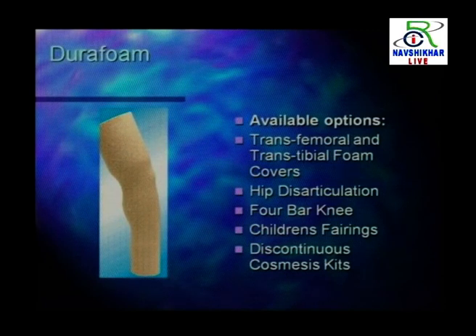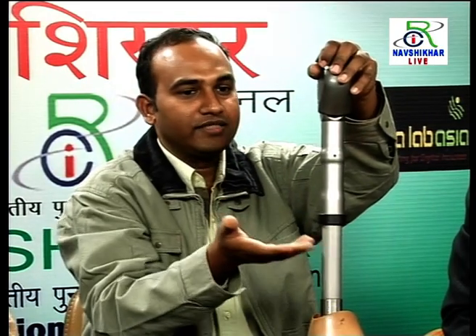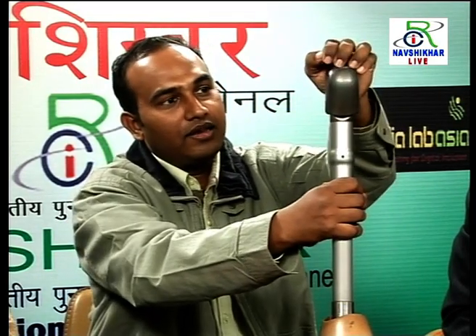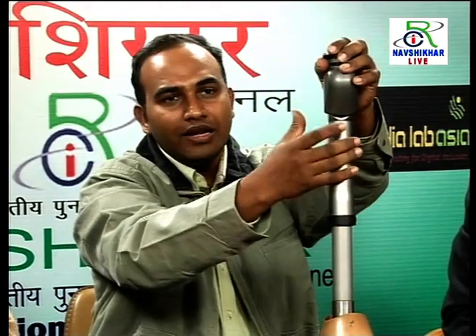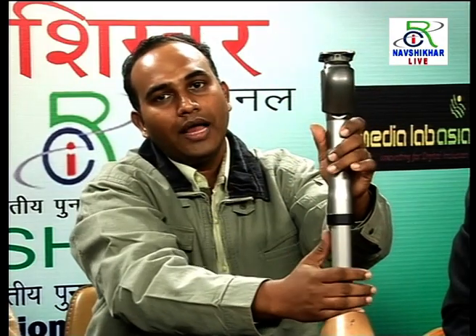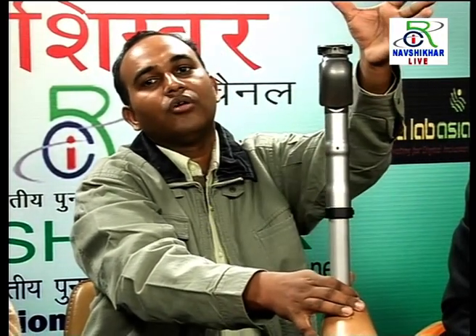Then there are cosmetic coverings that are supplied with the above knee components or below knee components, when all the systems are incorporated. If a patient wants to go out, say a female patient wearing a short skirt, it will be open, so definitely it will look very odd, like a robotic leg. So every company supplies covers; some patients use them, it's basically a patient choice. It's a leg shape cover, very lightweight and water resistant. The cover will be in the shape of a leg, and it comes in different colors, and different kinds of stockings can be used. So the whole thing will look like your normal leg basically.